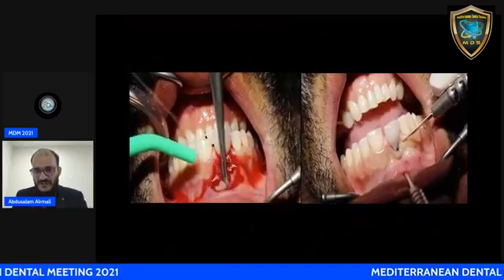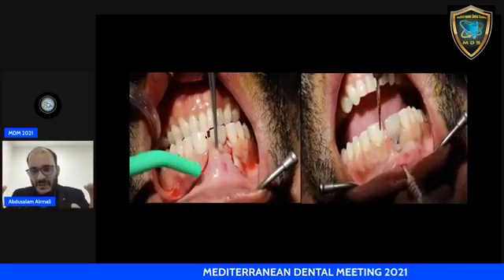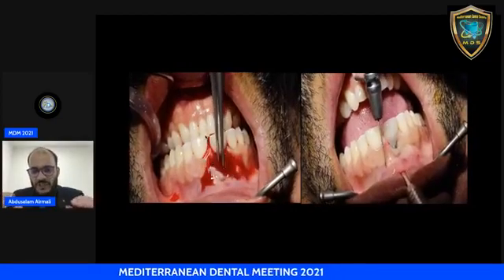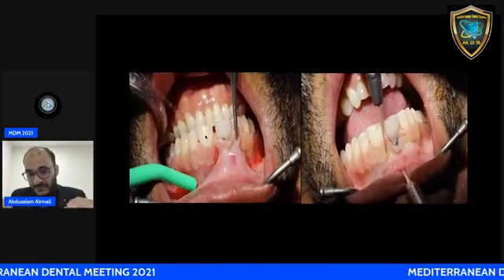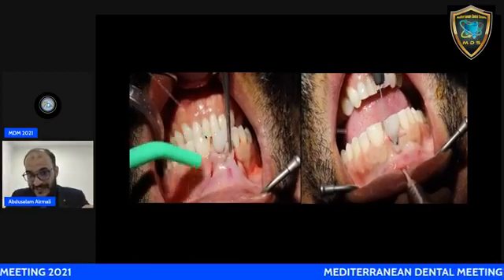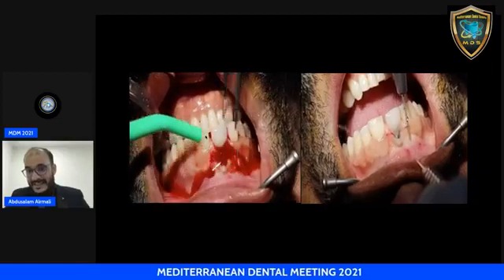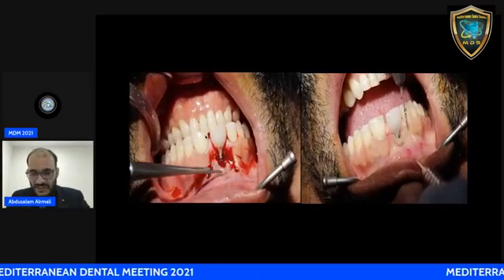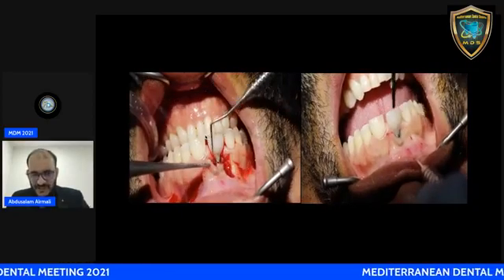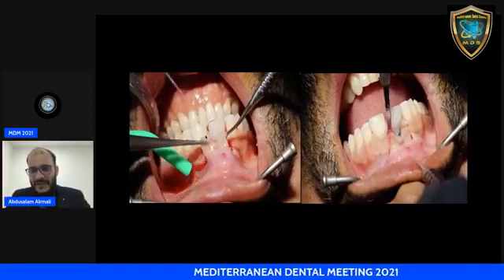Now, on the day of surgery, as we can see, we have big, large, wide interproximal soft tissue. You can do your incision now at the base of the interproximal papilla, mesial and distal, adding two vertical releasing incisions, mesial and distal, the conventional trapezoidal flap, with a single incision even around the teeth, the same. Try to split the papilla.